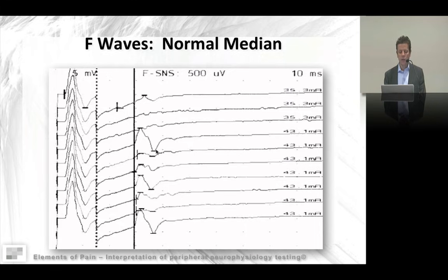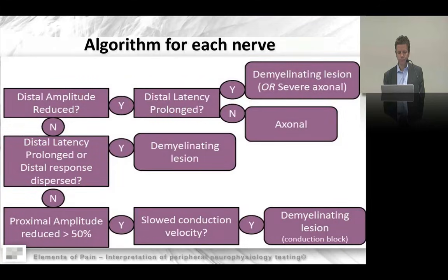But these F waves are very different. They're much smaller, because a different subset of the motor neurons fire back every time. But essentially the latency should be fairly consistent, and it's this earliest or most consistent latency that we use. And basically there are normal values according to the height of the patient that can determine whether this latency is prolonged or not. F waves can also be useful if they're definitely absent in someone who has a normal CMAP. It suggests there might be an underlying problem with the peripheral nerve at an earlier stage, given that you really should expect to see some responses.